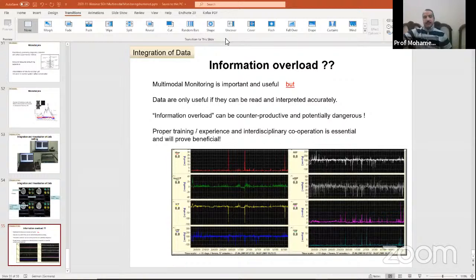Yes, Professor Hassan, please. You see, there's a difference between monitoring and measurement. The probes are for monitoring, minute by minute. The transcranial Doppler, EEG, whatever, these are diagnostic measurements at that time. Here we are talking about monitoring, where the patient is under continuous surveillance, like you see his PO2 continually and you see his ICP continually. So you can do that with EEG, but it's not really monitoring.